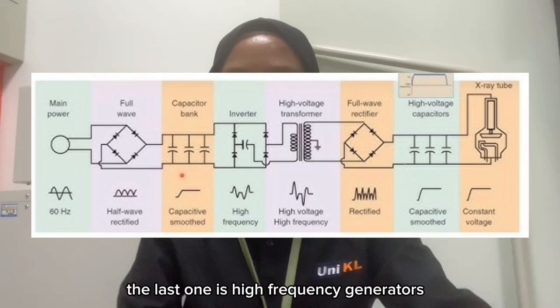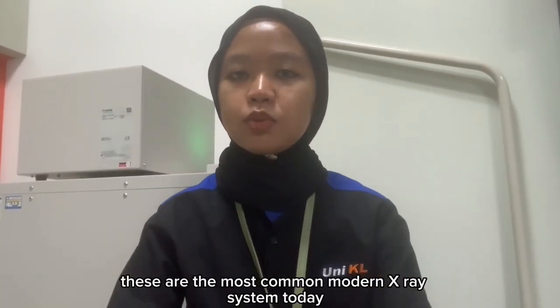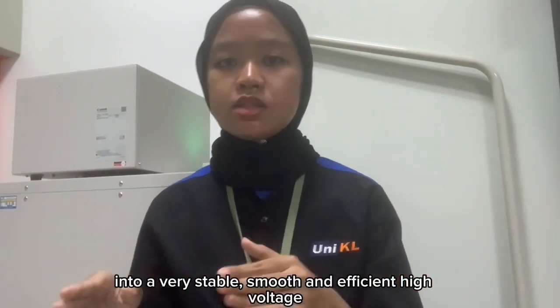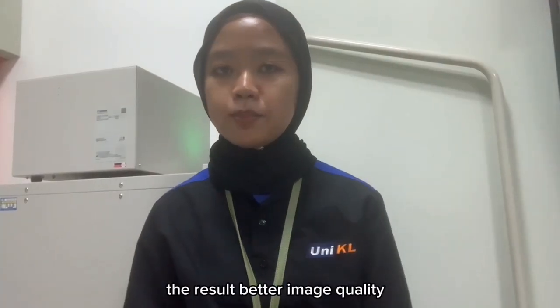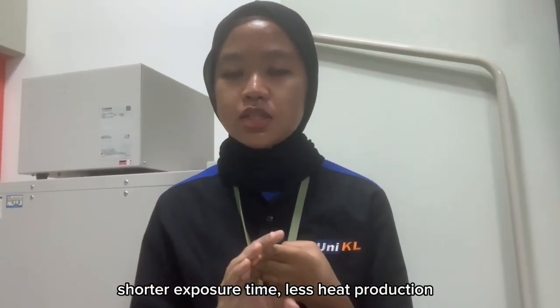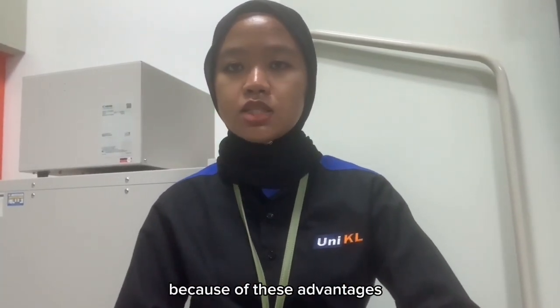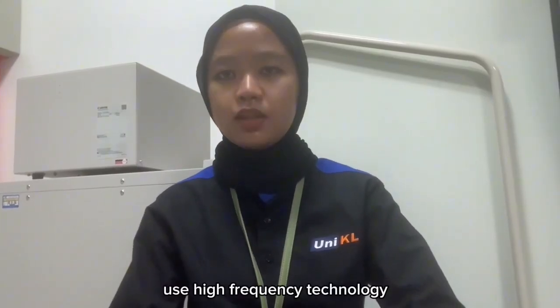The last one is high-frequency generators. These are the most common modern X-ray systems today. High-frequency generators convert the input power into a very stable, smooth, and efficient high voltage. The result: better image quality, shorter exposure time, less heat production, and lower radiation dose to the patient. Because of these advantages, almost all current radiography machines use high-frequency technology.